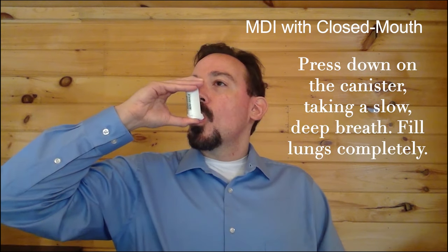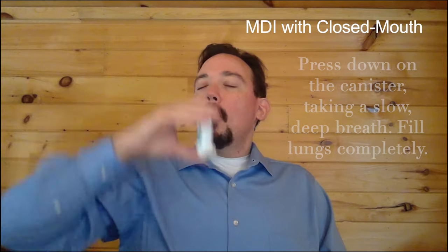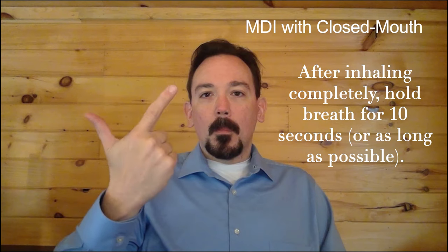Press down on the canister while you are taking a slow deep breath, filling your lungs completely. After inhaling fully, hold your breath for 10 seconds or as long as possible.